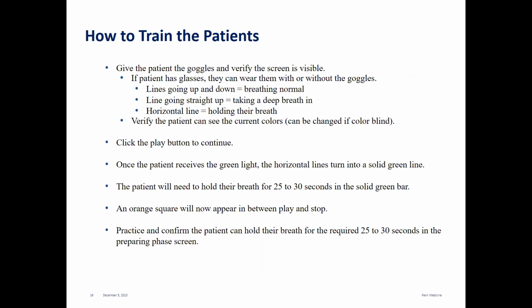So you also want to verify that the patient isn't colorblind. That has happened to us. If that is the case, you are able to change the colors. You're going to click the play button to continue, and once the patient receives that green light, you're going to have them take that controlled deep breath up into the horizontal lines, into that solid green bar, and you're going to see if they can hold for 30 seconds. If the patient's ever not able to hold for 30 seconds, they can go ahead and just breathe normal.